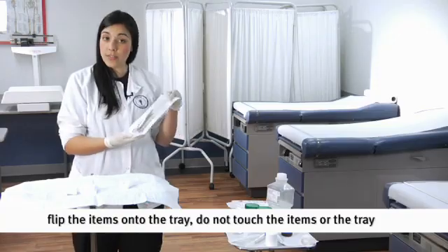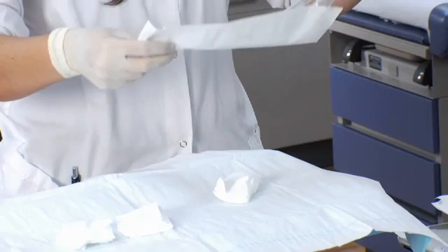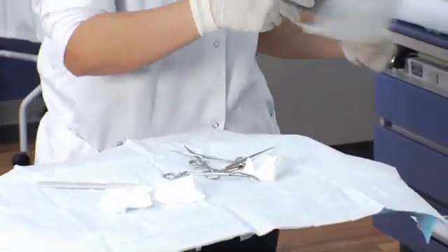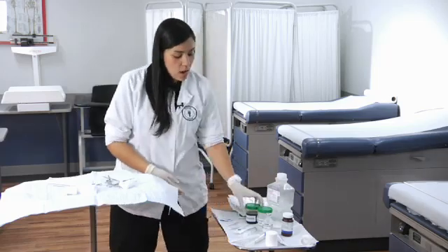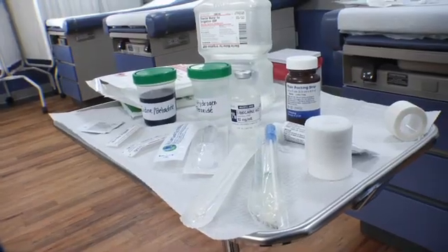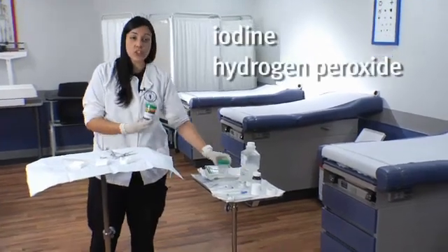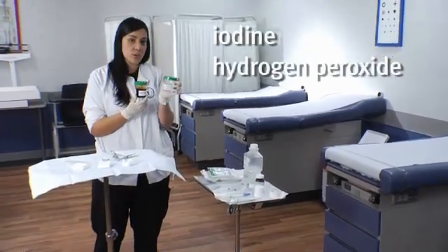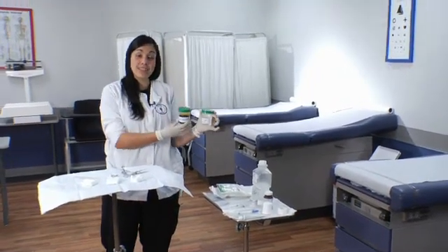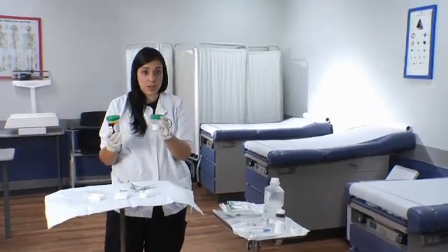Same thing with the instruments — bring up the little package and try to lay your instruments across as best as possible. A couple other things that are going to be not on your sterile tray, but in an easy-to-reach area, are additional types of supplies that the doctor might need. The most commonly used antiseptics for this procedure are iodine and hydrogen peroxide. Depending on the physician's preference, you might have to hold these and assist, or some physicians like you to actually pour the contents onto the sterile field.